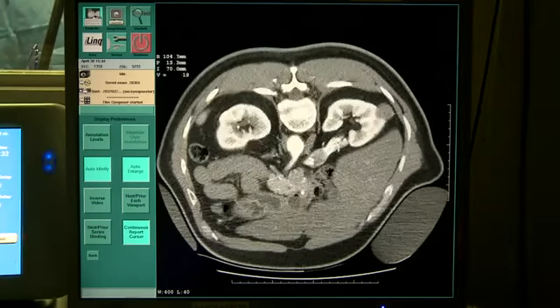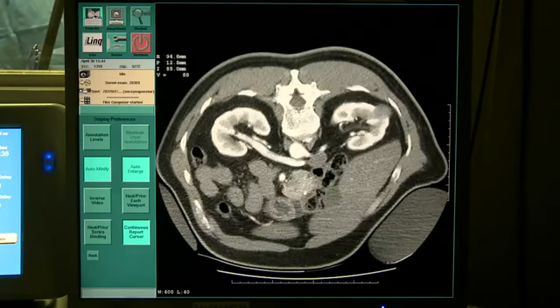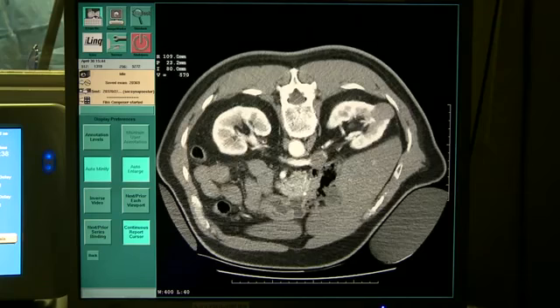These are the contrast images, and we can see the lesion with much better conspicuity. Unfortunately, the long axis of this lesion is not favorable for us today, but we'll still be able to handle it. We'll go into that more as we go. Right now we need to pick our table levels, which we're not seeing on this anonymized protected image, but we'll choose our levels and come back.